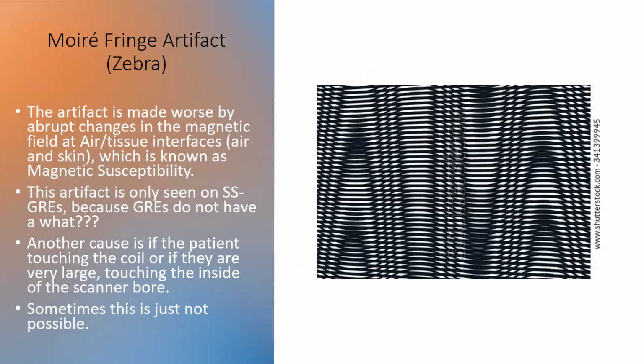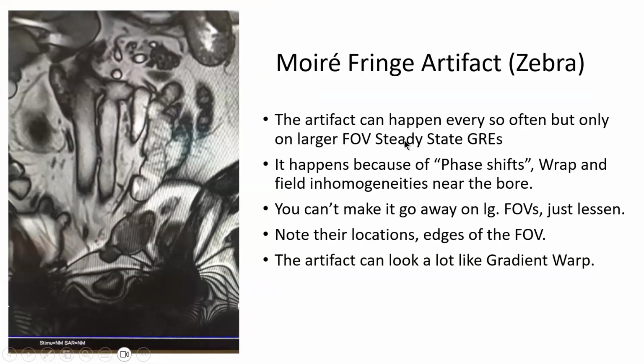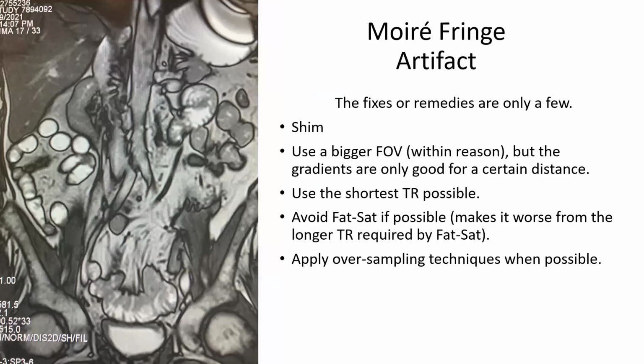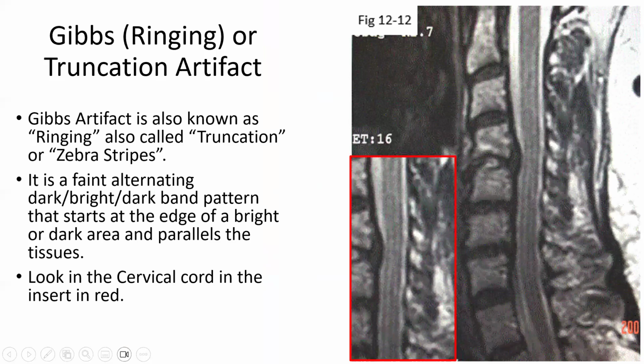When you've got geometric lines going in opposite directions, that's basically what you get. Okay, here's down the bottom right, bottom left, that's Moiré artifact. All right. Here is Moiré artifact. Once again, you look at this image, oh, that doesn't look too bad, but look up the top here. That's Moiré.